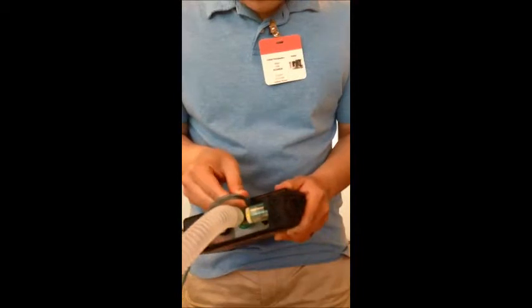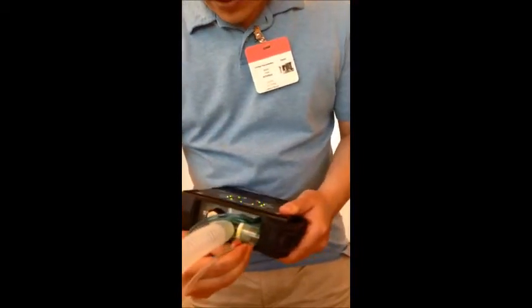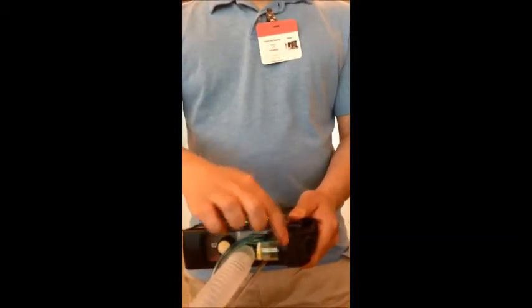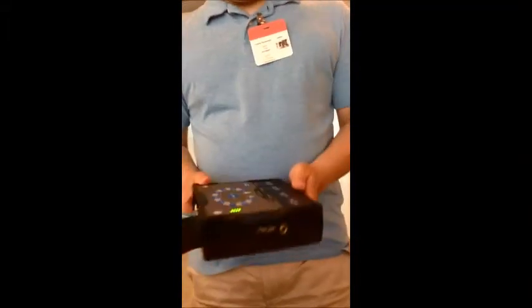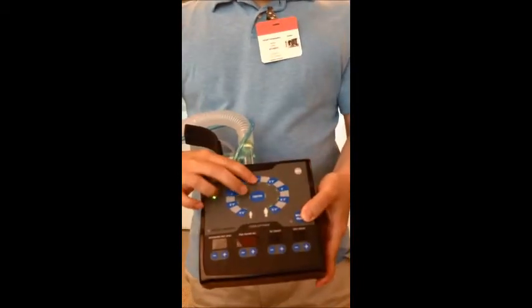So we have the pressure line and the control line. We also have, if the patient has to breathe on their own during an exhale, they can pull air in through here, independent of the ventilator delivery. So going back to the initial, we'll select a height of the patient.